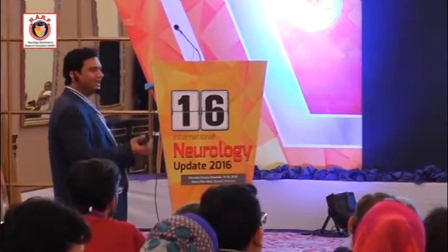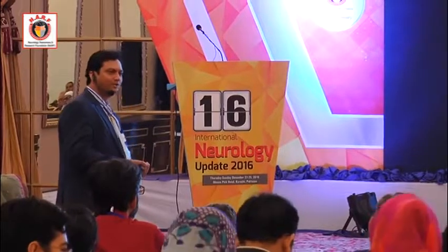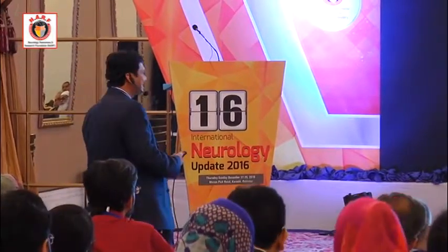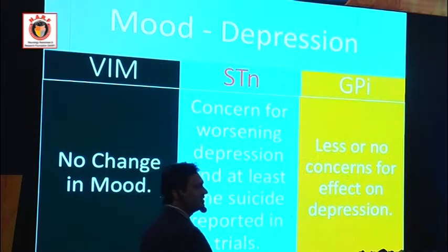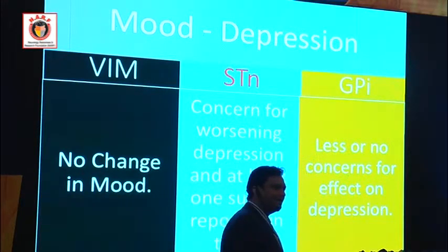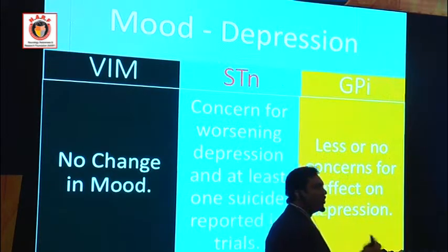Mood and depression, again VIM very safe. If you have a neuropsychiatric patient and you need to control tremor, you can do VIM, but STN can worsen depression, and there is at least one suicide in a patient who had STN DBS in the trial, while GPI seems to be safe. Again, these are small numbers.